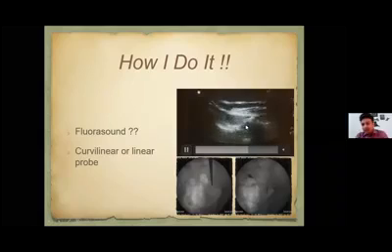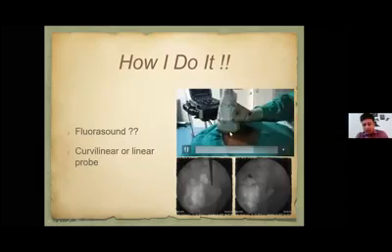So this is the sacroiliac joint. This is the lateral crest of the sacrum. This is the ilium. This is the sacroiliac joint. If you move up, you can see the S2 foramen and S1 foramen. I am sorry, I am not able to show that in this video.